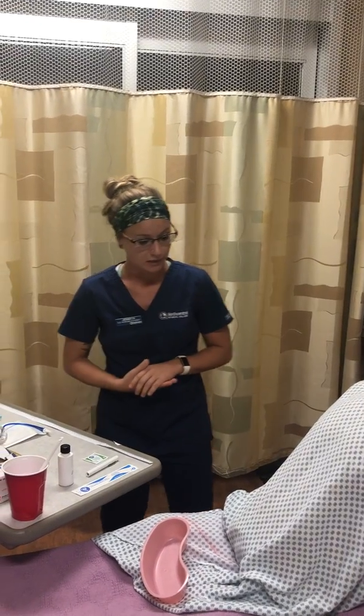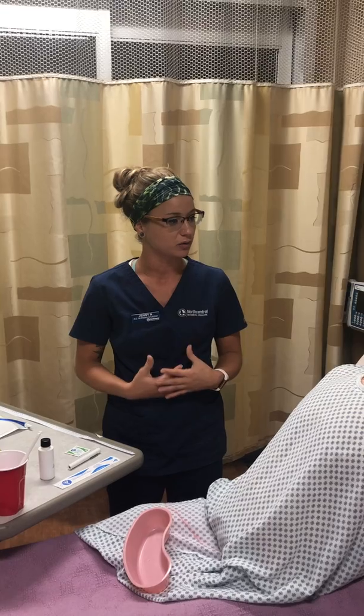Okay. Jennifer, I'm here because you have a bowel obstruction, so I have an order to place a nasogastric or NG tube in through your nose that'll go into your stomach. The purpose of that tube is to help allow, hopefully, that bowel obstruction to heal on its own through the use of the NG tube.